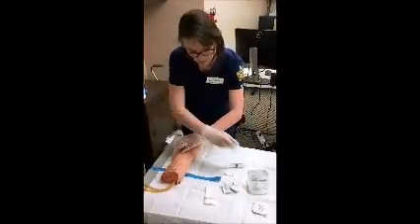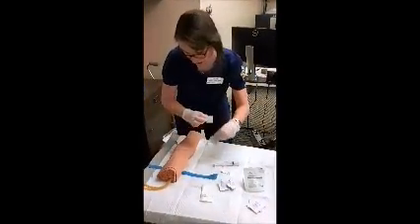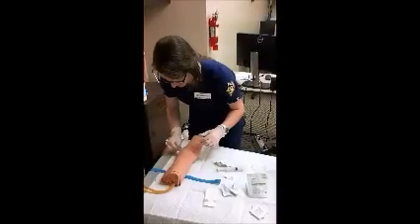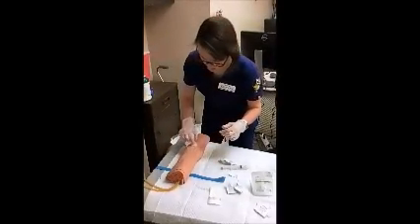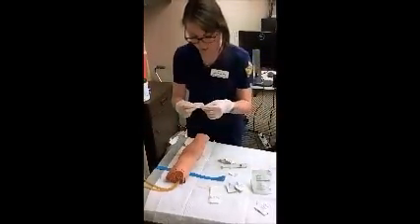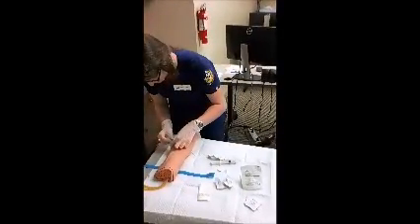We'll take our piece of gauze. First, let's clean up, just in case we got a little bit of blood on him. I didn't this time. And we'll just kind of clean up around the IV site, being real sure to not get this near that open site because it will sting and your patient might be a little cranky. We're going to fold this and tuck this right under here, kind of prevents that skin breakdown there.